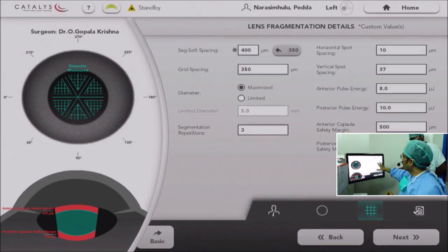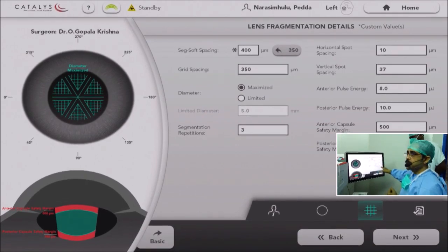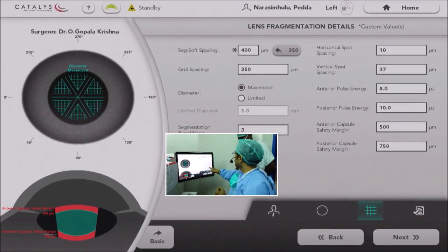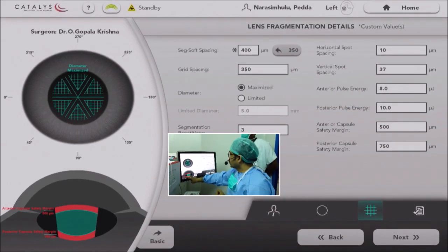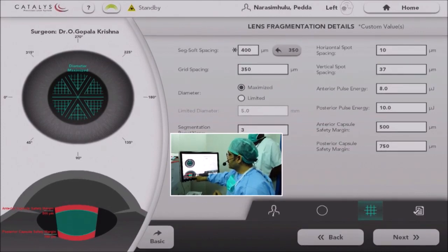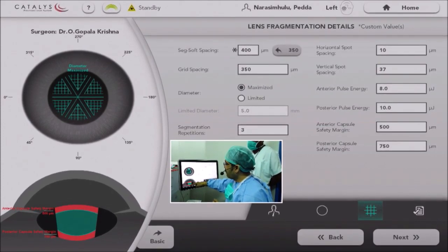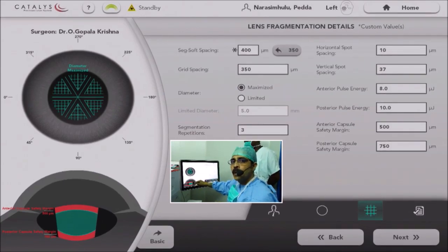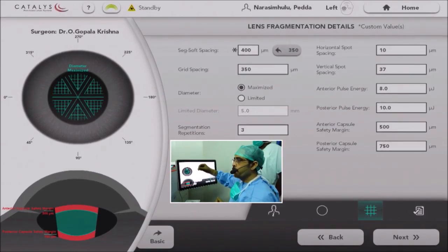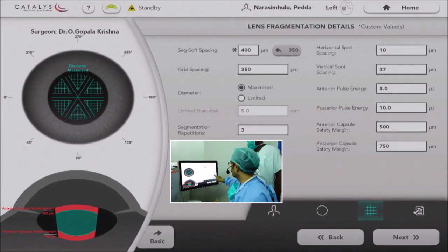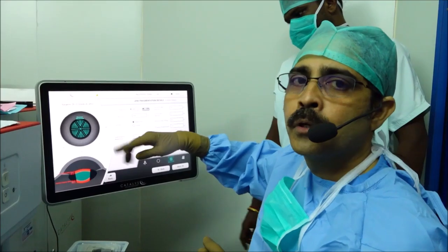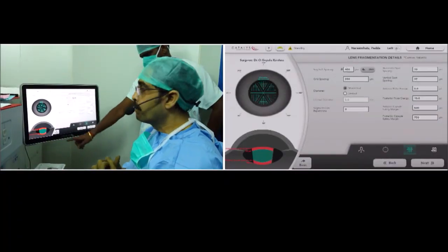These are the lens fragmentation details. You can set horizontal and vertical spotting. The most important parameter is the posterior capsular safety margin — you can fix where the laser firing starts from. In this case I kept it 750 microns from the posterior capsule safety margin. So my laser starts firing 750 microns anterior to the posterior capsule, so that in no way the posterior capsule is damaged. The cavitation effect extends only up to a maximum of 100 microns, so the laser spot is almost 650 microns away from the posterior capsule.